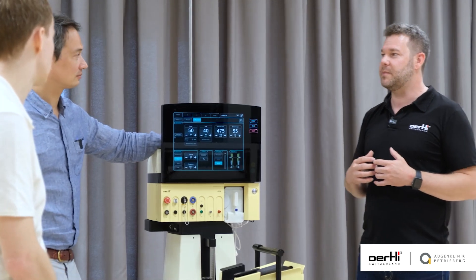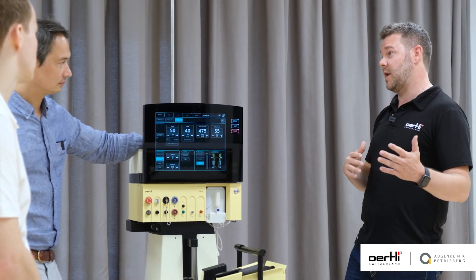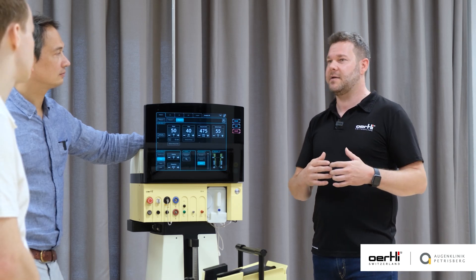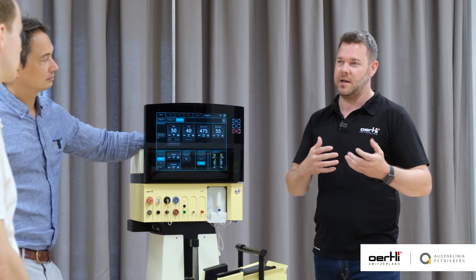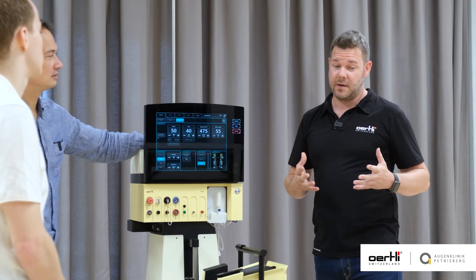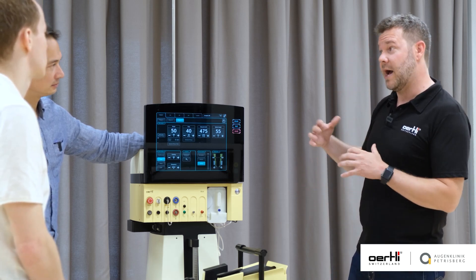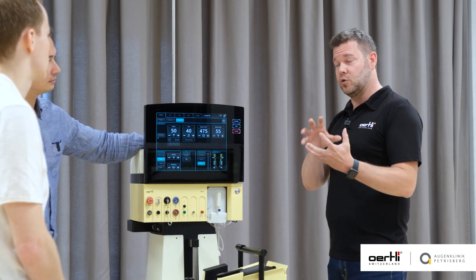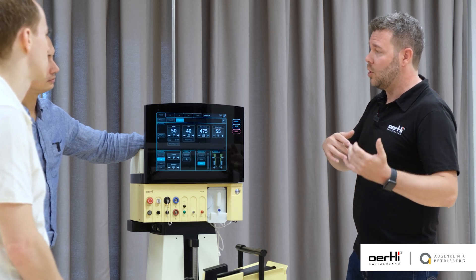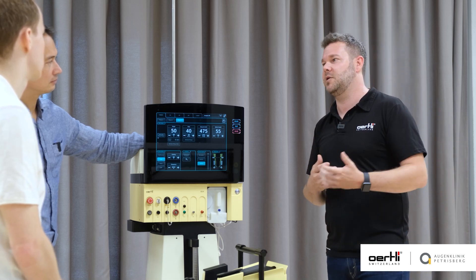For a new surgeon, the Venturi pump is probably more intuitive — you press and something happens. On the peristaltic pump things can be a bit delayed because you need occlusion first to get proper vacuum. However, the peristaltic pump is good for beginners because you can work with a low flow and a high vacuum, giving you good holding power on fragments while keeping things slow and controlled in the eye.